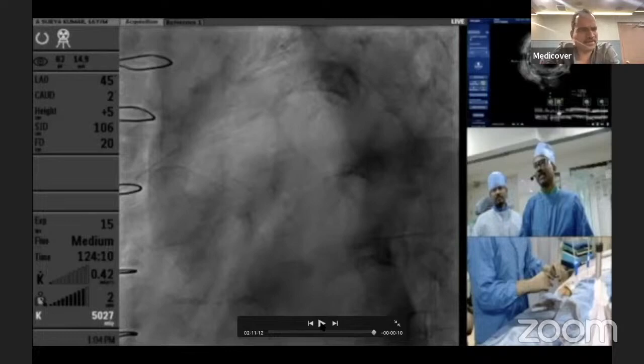That is mostly a kind of dilutional effect. Or if you have some fenestration, many times what happens, even in a subintimal space, you dilated, or your wire is in the subintimal space. Sometimes you create some perforations into the true lumen. We are not sure where the perforation is, but when you are giving contrast, that contrast can go into your true lumen through those small perforations, or small connections between false and true lumen. And that is the whole logic about the investment procedure.